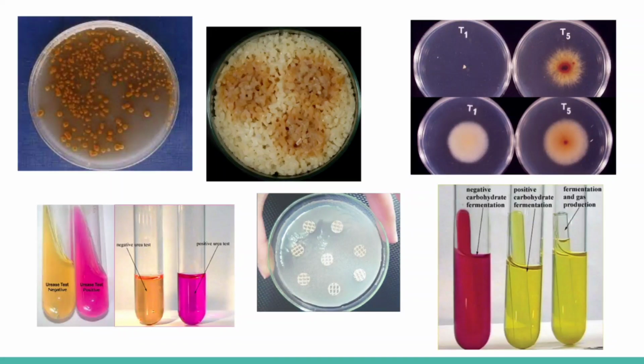So, next we have also the cottonseed agar. So, mapapansin nyo, for the yeast phase ng Blastomyces dermatitidis. Next, rice medium, literal na kanin. Tutubo dyan is your Microsporum audouinii. Next, we have the trichophyton agar. So, yan, T1, T2, T3, T4, T5. Yan, madami yan. Hanggang 7, no? 7 different media.